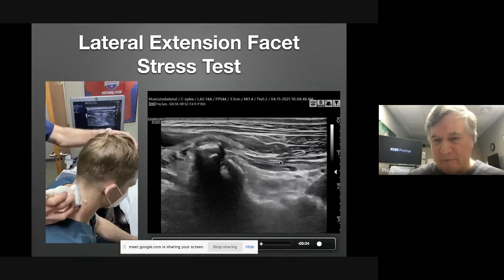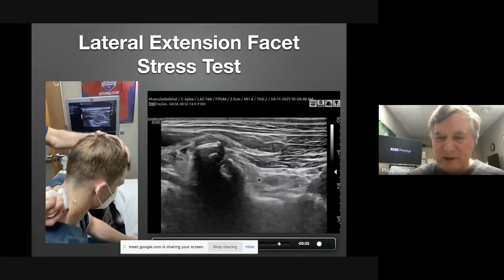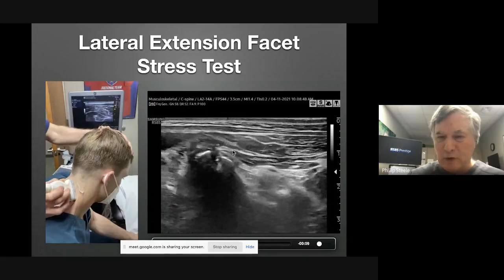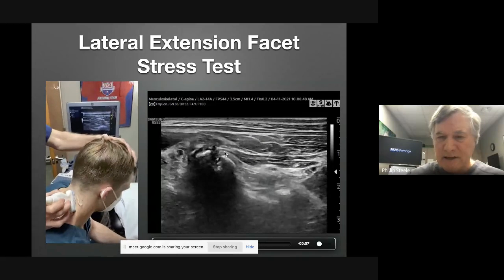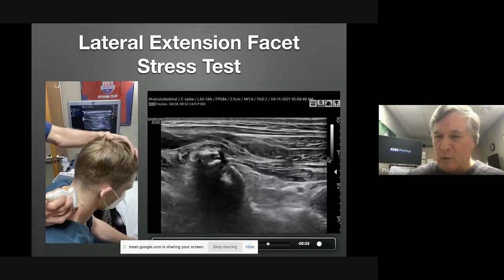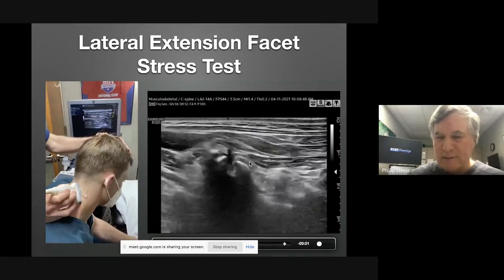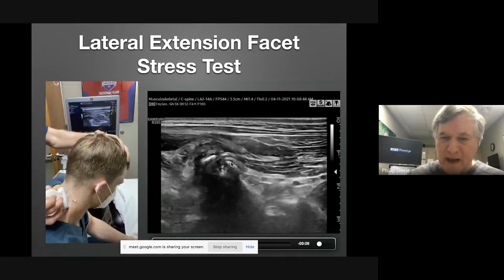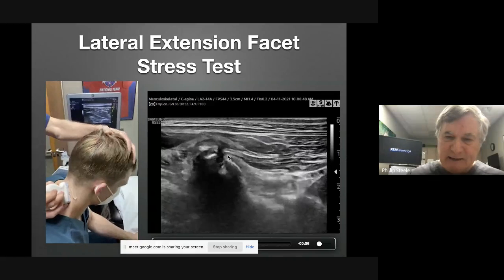This might be a target for platelet releasate to improve muscle development. I could see that the septal portion is fairly thin, and it does not appear to be unstable in this view, but I may want to address it more proximally. And the multifidus, when I pull on that, seems to be intact into the capsule.